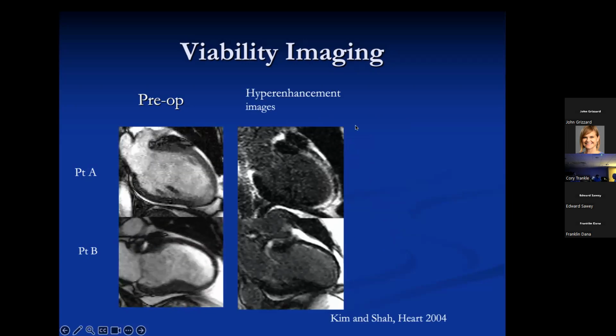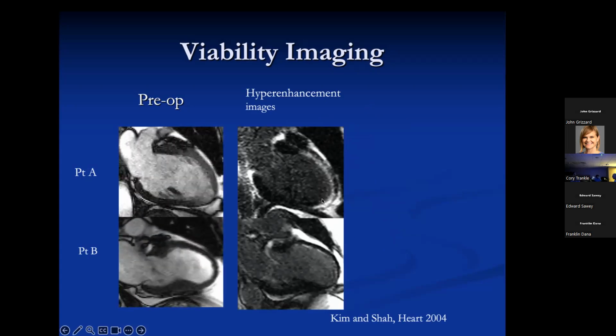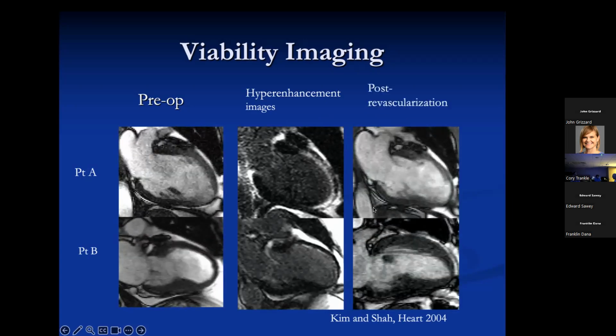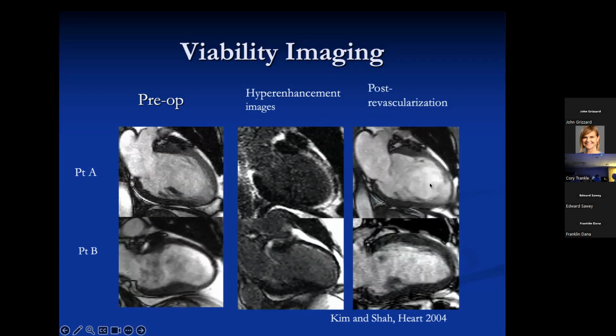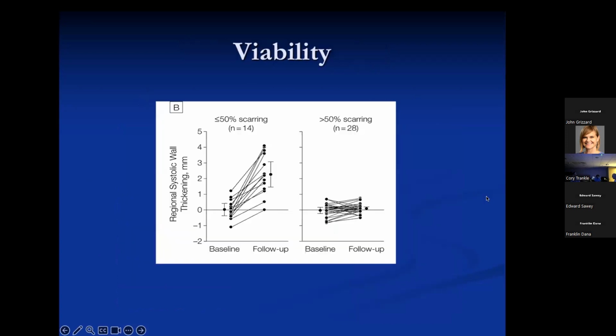So who's going to get better if you revascularize him? Right? We've said that if you have 50% or more, you're not going to recover. This guy has way less than 50%. So indeed, this is like science fiction. You think, oh, this can't be right. But it's true. These are real cases. They really can recover profoundly.